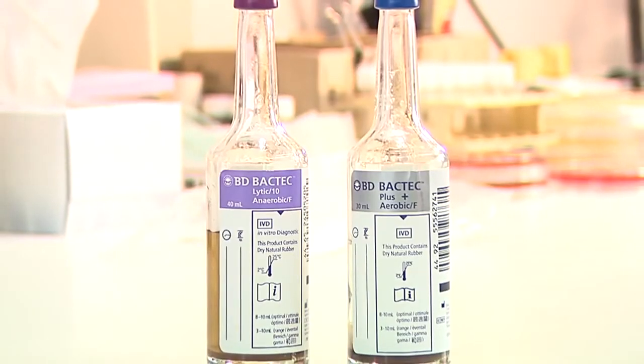Bacteria and other pathogens can get into the bloodstream in various ways, most commonly from an infected site, such as an abscess or tissue, or from an infected organ, for example, the kidneys, or from a colonized intravascular line that is inserted into the patient. A blood culture involves aseptically taking a sample of blood, usually 5 to 10 ml, from a patient's vein, and inoculating it into commercial blood culture bottles.